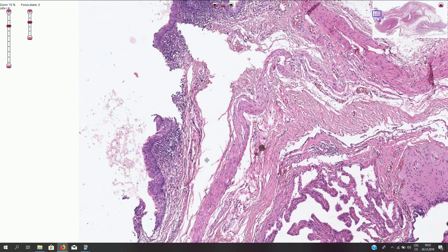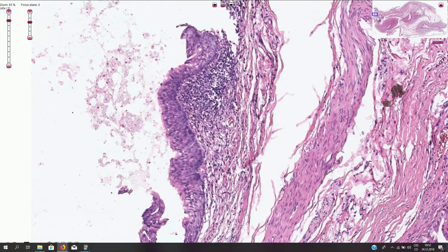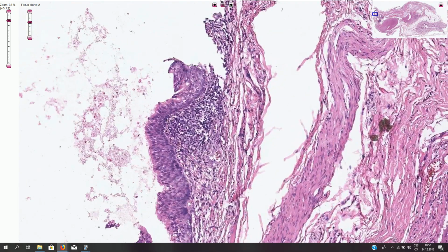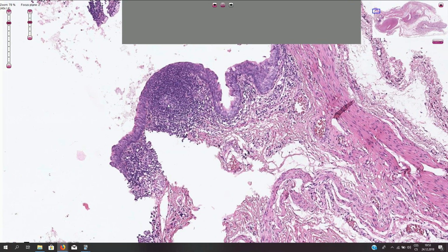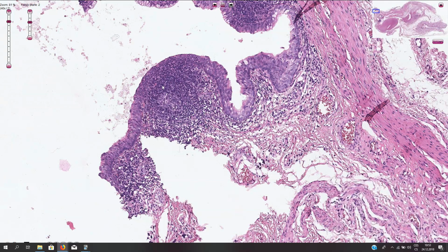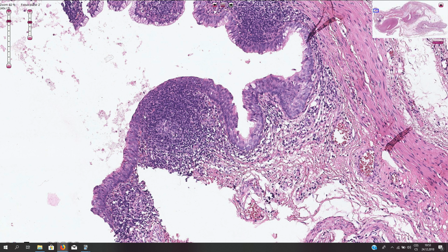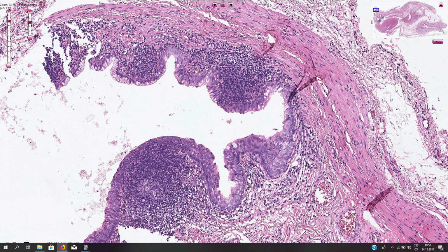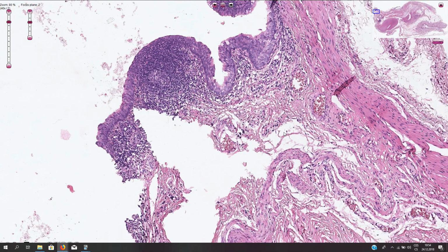And if we go farther, here we see something that looks like respiratory type of epithelium, and it really is. So pseudostratified epithelium with ciliated surface. And here we have lymphoid tissue with the follicles or lymphoid follicles with small activated germinal center composed of centroblasts and centrocytes. So this resembles maybe nasopharynx with the tonsillar lymphoid tissue. Here we have again the smooth muscle component, some lymphocytes, blood vessels, and loose fibrous tissue here.